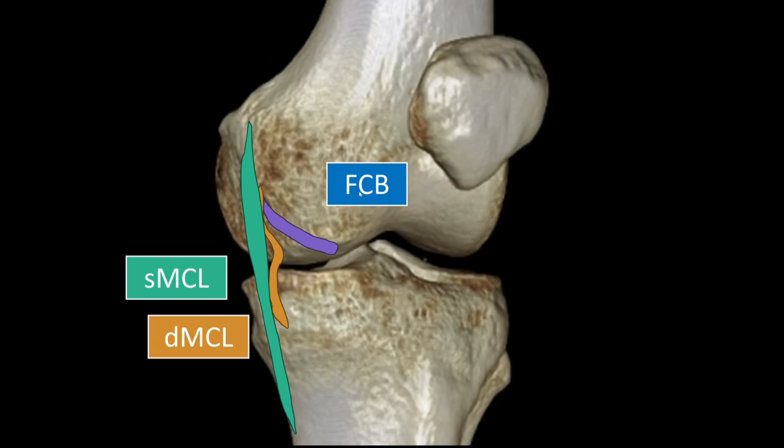This structure is called the FCB — the fascicular capsulofemoral band. I'll show you this in a real case in just a second.